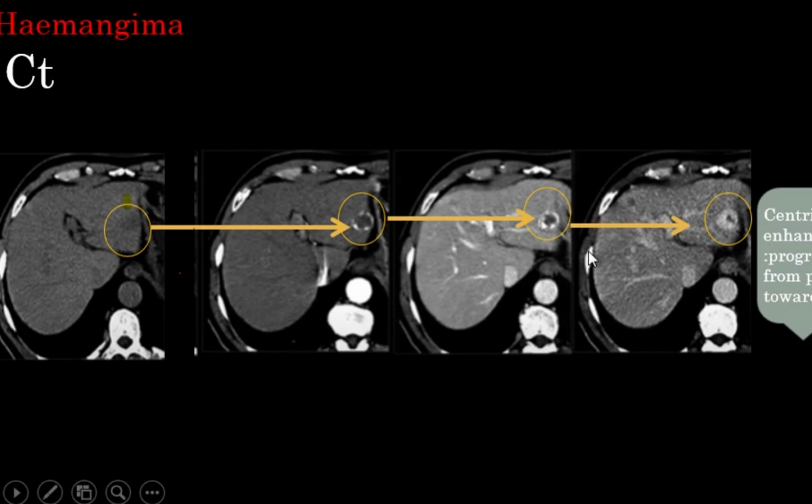So we must be careful. It must show peripheral, nodular, interrupted, centripetal enhancement. These four criteria are required: peripheral, nodular, interrupted, centripetal. If it was not interrupted, this is not a hemangioma, think tumor. If it was peripheral, centripetal, nodular, but continuous, think maybe tumor with central necrosis.